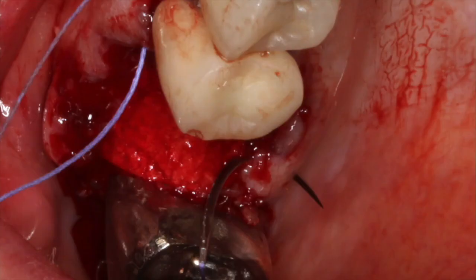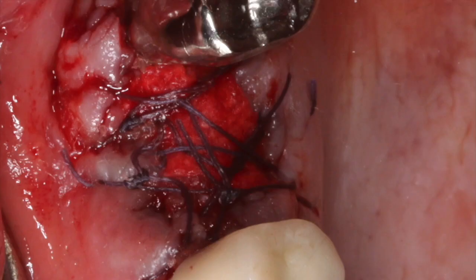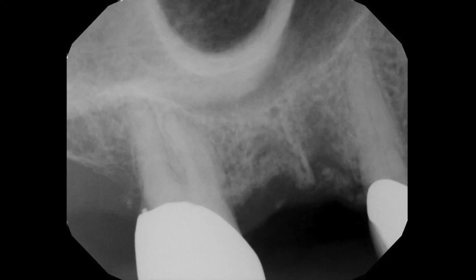We'll then allow this site to heal. I like to bring my patients back in a week to remove the sutures. We just have an ideal situation for a future implant.